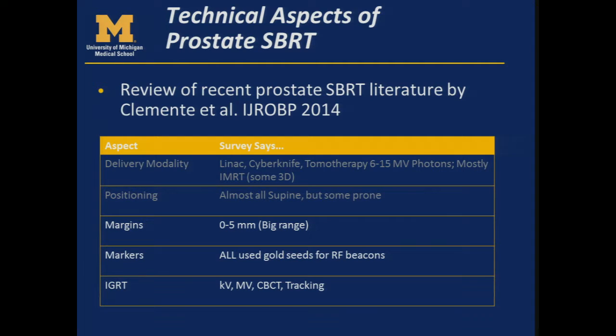This is something that I think we have to be very careful about. Many of you may have seen the paper a few years ago looking at the reduced local control and outcomes for prostate cancer using IGRT in small margins. So you just have to be careful. You want to make sure that your margins are appropriate with your IGRT, and I think each clinic has to evaluate that on their own with their own technology.